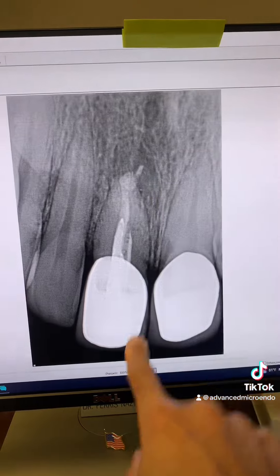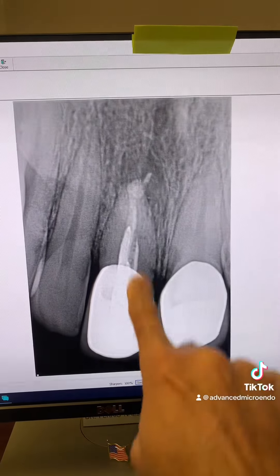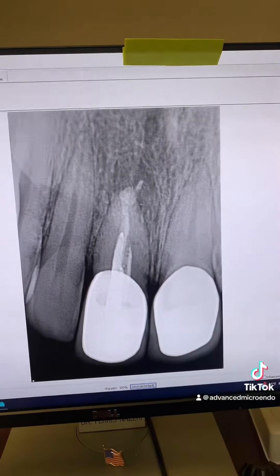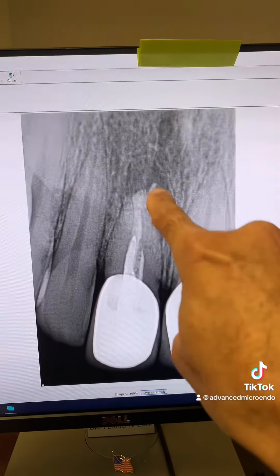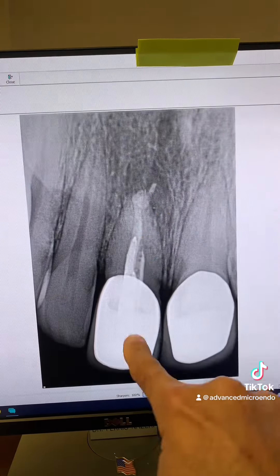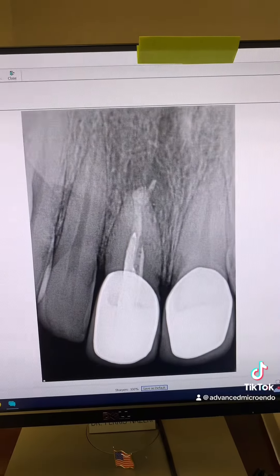Here is the post-op. Today we went through the porcelain crown and removed the fiber post. We removed the old gutta-percha using chloroform. The apical diameter turned out to be over 60, so I placed an MTA plug followed by gutta-percha and sealer, temporized the tooth, and referred the patient back to his dentist for the permanent restoration.